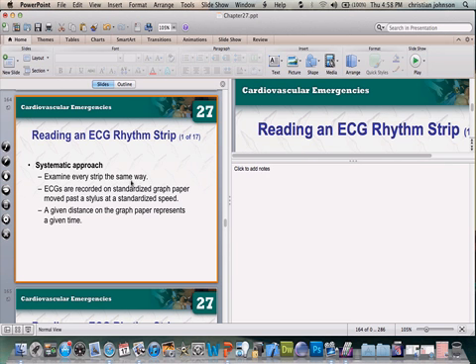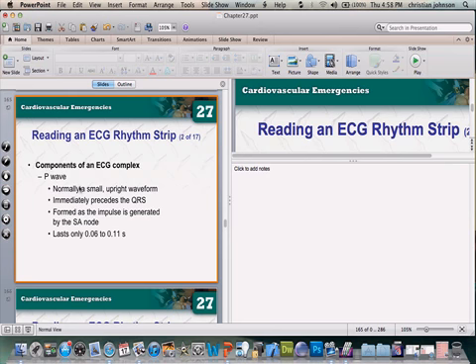That's not good paramedic practice, because there are many instances where you think you know what you're looking at, but on further review you're missing a PAC, or you're missing that the patient is actually in AFib, or in a junctional rhythm, or you miss a first-degree heart block. You have to take your time and examine EKGs in a systematic way. That is very important. Don't get lackadaisical, especially when you're first starting out reading these EKGs, all right?